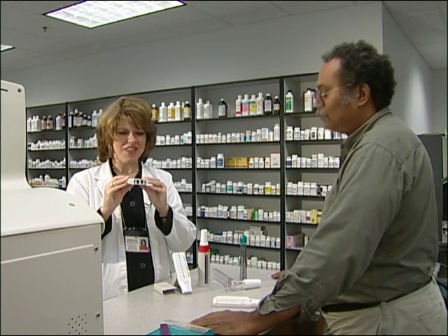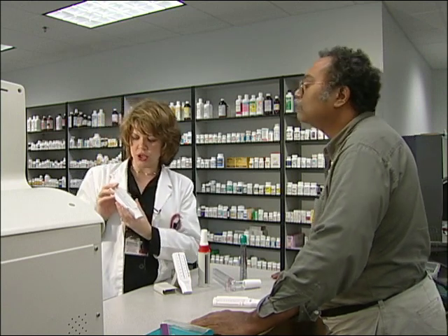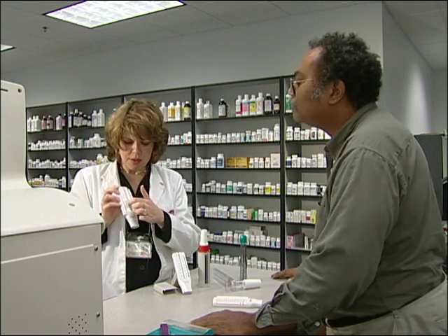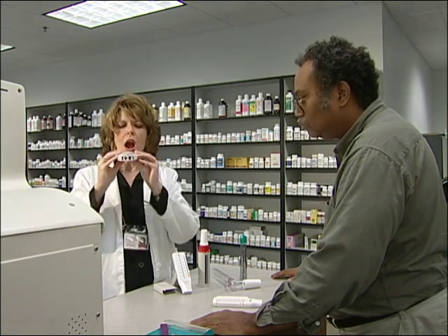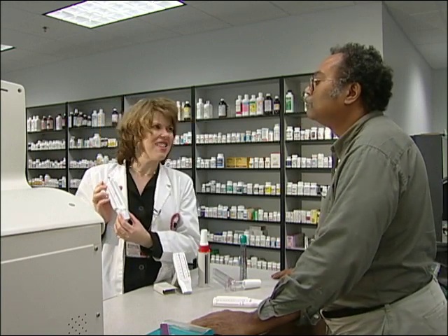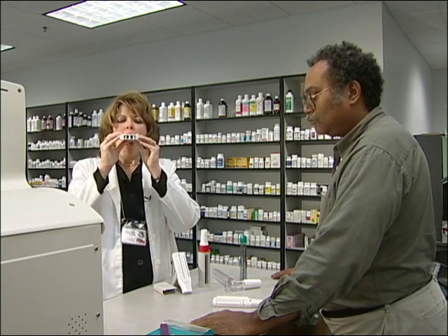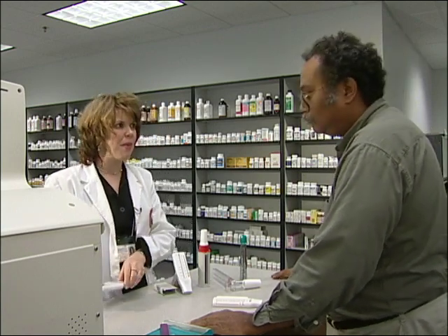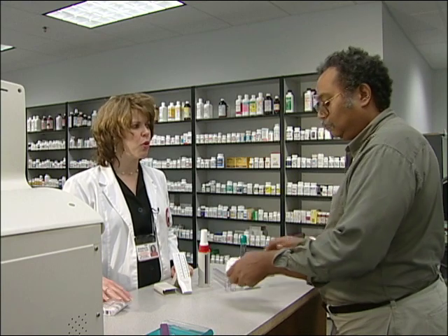So I'm going to show you how to do it. You breathe in and blow out as forcefully as you can — that time I did around 400. Then move the red indicator back to the bottom of the scale before the second attempt — around 420 that time. Then move it down and do it a third time — around 400. So taking the best reading of those three, my best peak flow would be 420, and I would record that in the diary your doctor gave you.